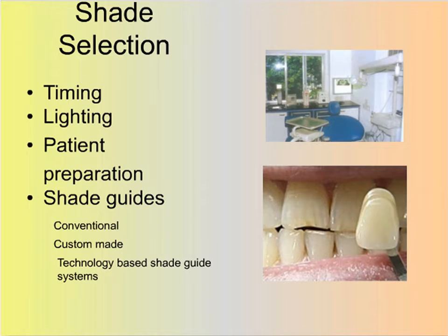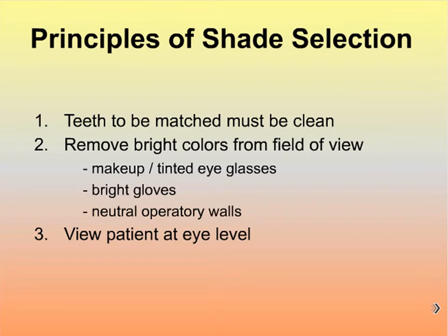The shade guides are either conventional, custom-made, or technologically based shade guide systems, or digital shade guides. Principles for shade guide: you can never take a shade on unclean teeth. Teeth must be clean. All stains and bright colors in the field must be removed.